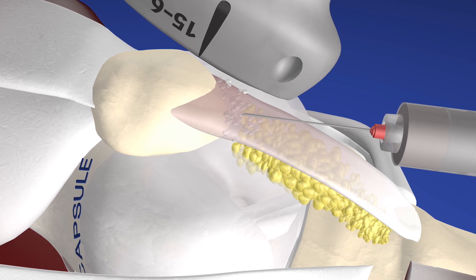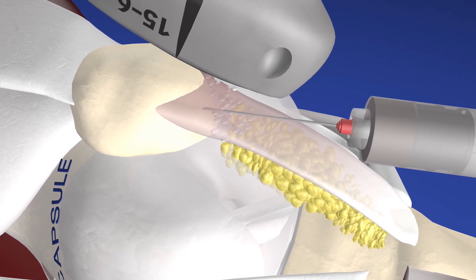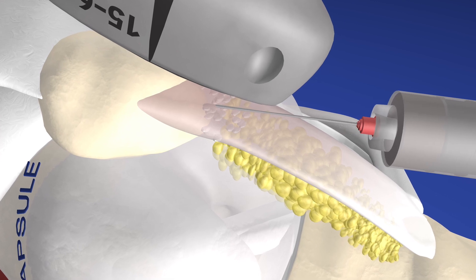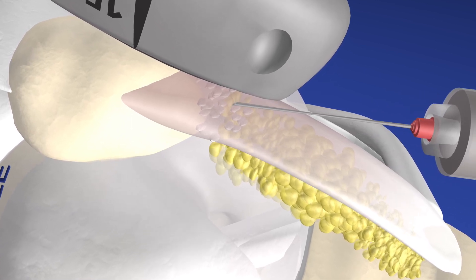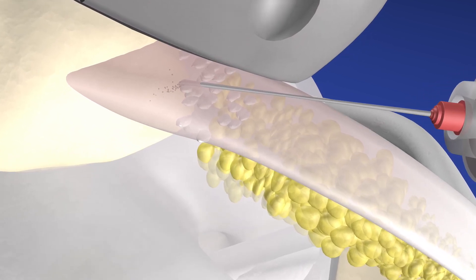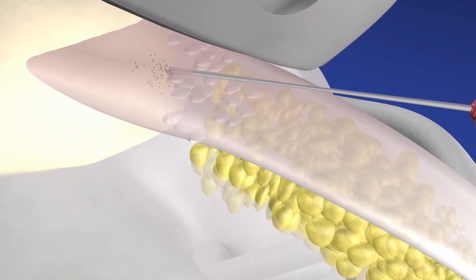We can also break up some of those calcific bodies with the needle and help the body resolve those by mechanically breaking them up. This procedure needs to be done with sterile gel and a sterile probe cover — the needle is essentially right under the probe. Here we are injecting the substance of the patella tendon with PRP, and that should conclude our procedure.